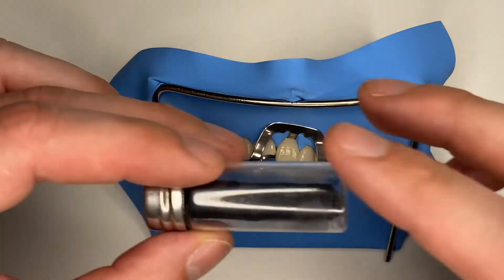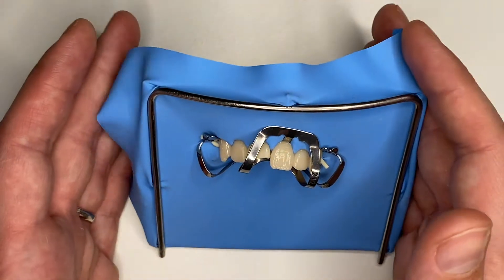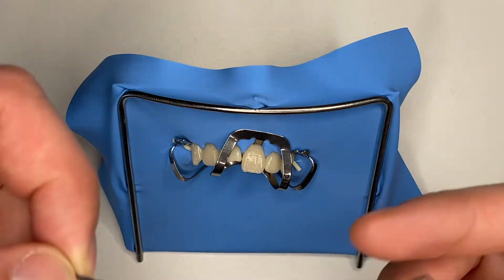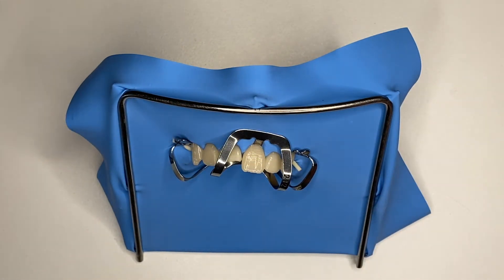The reason I'm going to use this is because it's black. If you've ever tried to use floss ligatures, you probably had some issues when trying to remove them — did you remove the whole thing? Well, if you're going to use black floss, you're going to see it, and this is a major advantage.